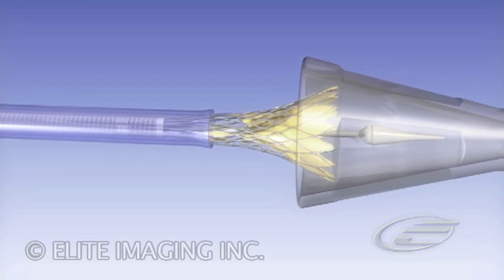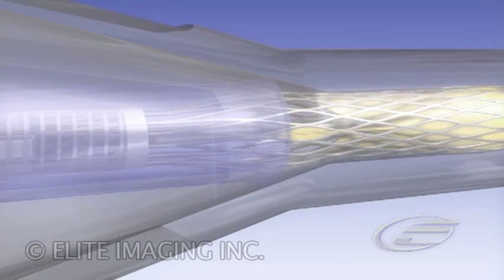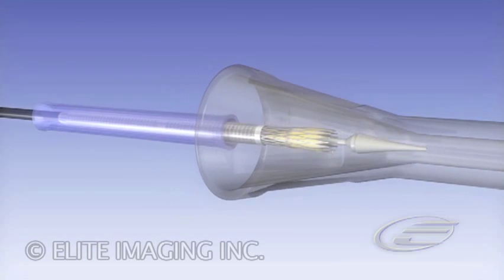Slide and advance the inflow cone over the inflow end until it touches the outflow tube. Load the valve by manipulating both the micro and macro adjustments on the handpiece. Remove the inflow cone.